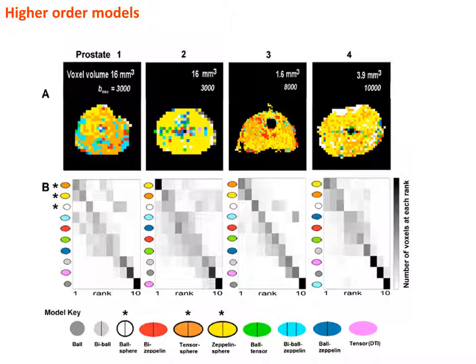Well, the anisotropy appears as an important component when we've got a 2-component model, and the isotropic component in this case is quite significant in terms of the signal, so it would be acting as an isotropic background signal that tends to mask the actual anisotropy in the tissue. So it's possible that anisotropy may be of clinical value, but in order to be able to characterize it, we need to fit 2-component or multi-component models to our signals.